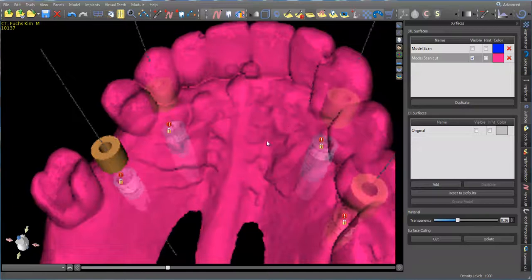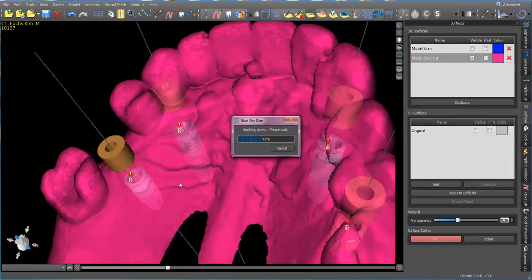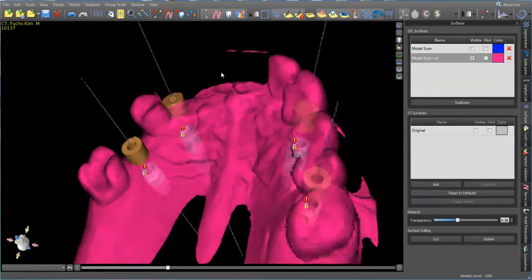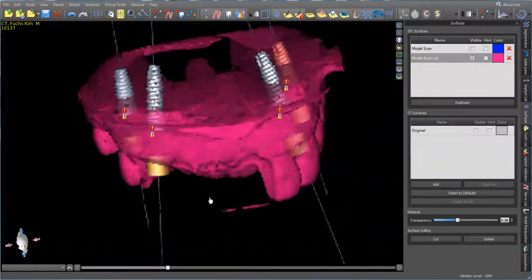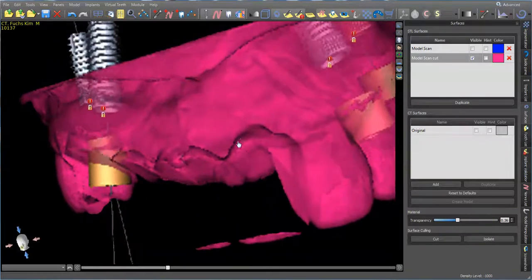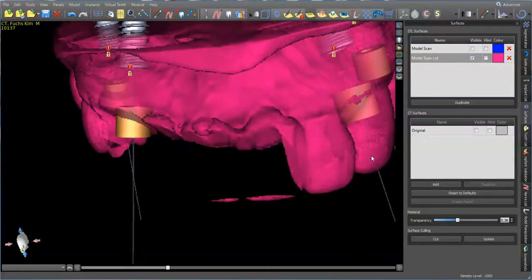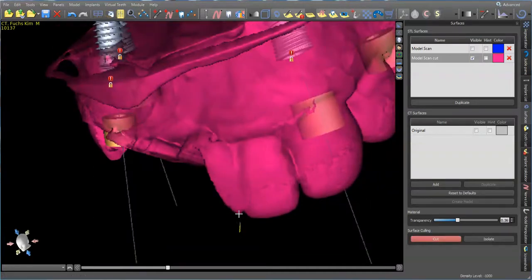So I'm going to go ahead and use our cut tool, back again. Cut along here, keeping that lateral. Inevitably, when you cut the mesh, you'll get an error. I'm okay. I don't want to trim too much of that lateral, because it won't allow the guide to seat. And you can kind of see how I'm cutting here. So what I'll do is I'll just use a cut tool again. Just remove this a little bit, and then just remove this little piece right here.